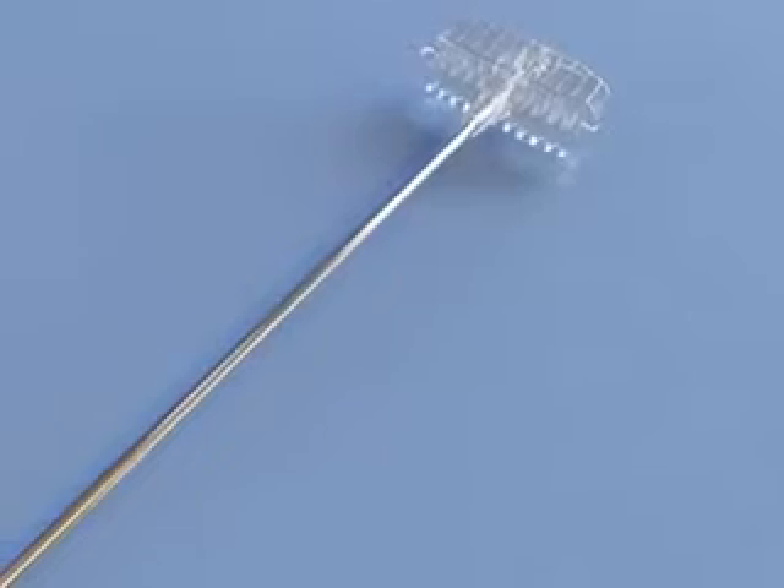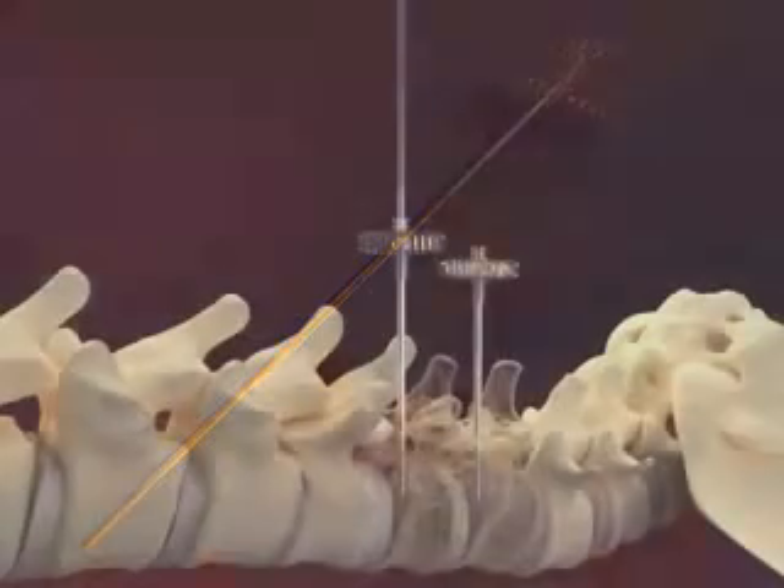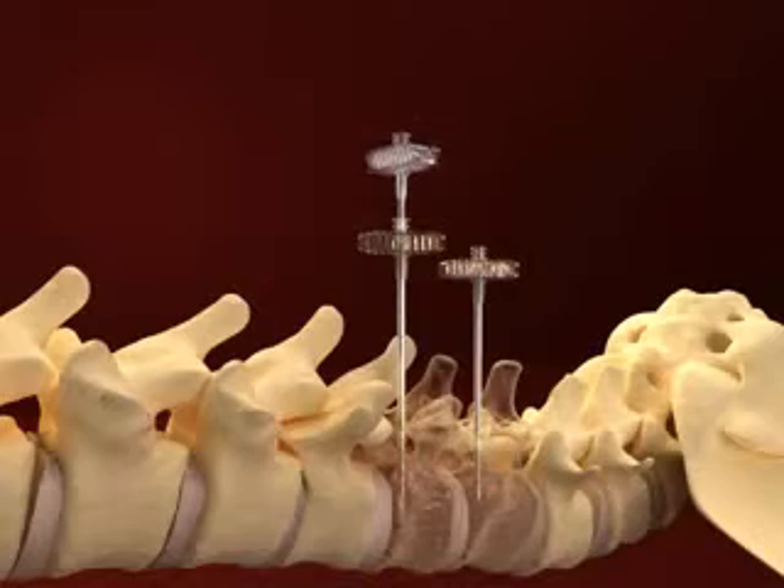Next, the VertiCore Straight Line Cement Staging Osteotome, a mechanical device, is inserted and used to create a cavity in the bone.